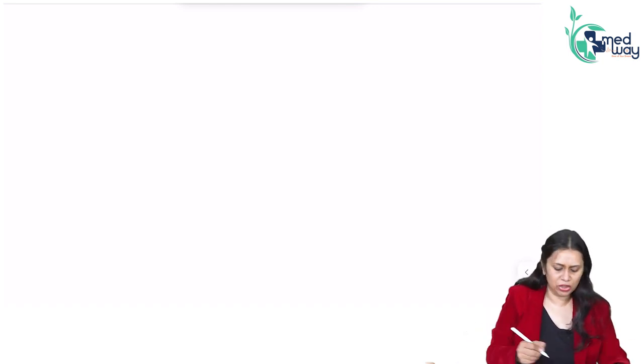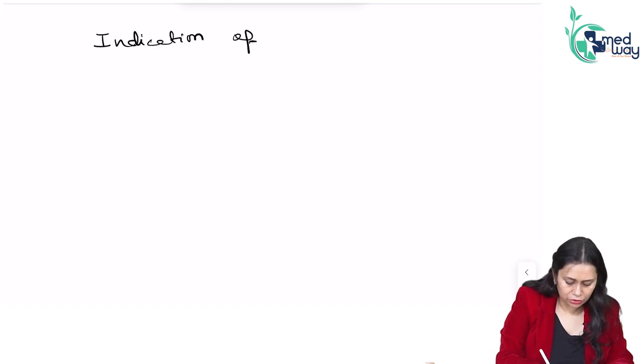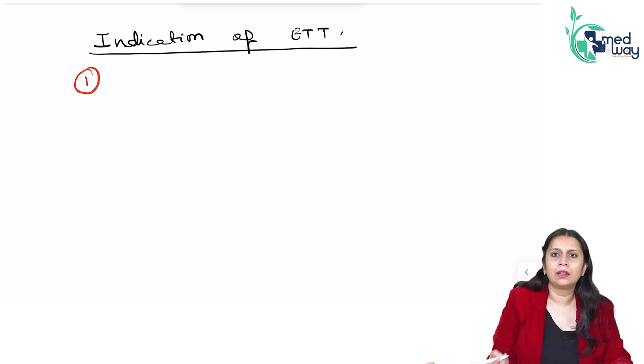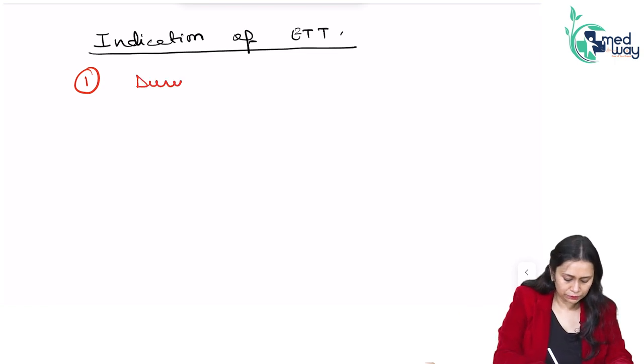Okay, so these are the special ET tubes I wanted to discuss. Now let us discuss the indications of endotracheal intubation. The most important indication, why I intubate daily, is during general anesthesia for positive pressure ventilation and for giving our anesthetic gases. So during general anesthesia, we intubate our patient.